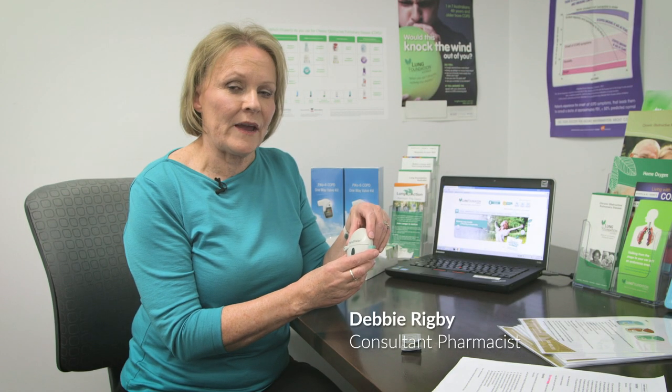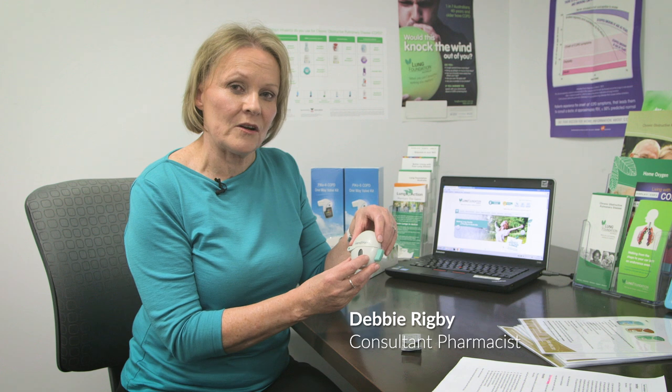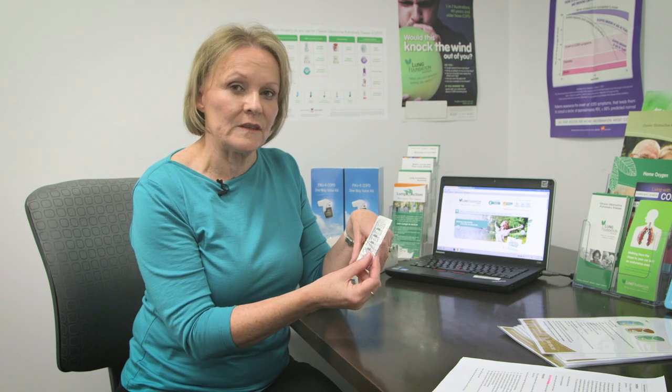This is a Handy Haler, a dry powder device. It comes with the device and the capsules to put in the device. I will talk you through the steps and then demonstrate.